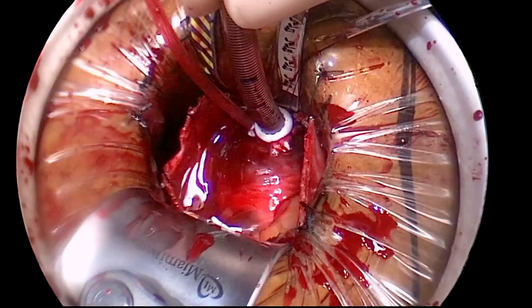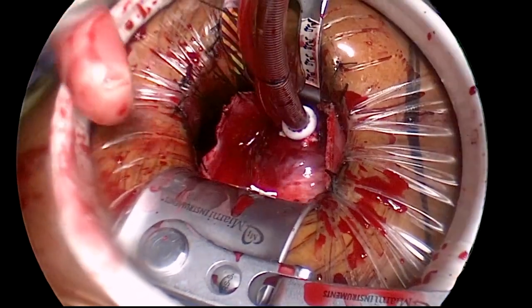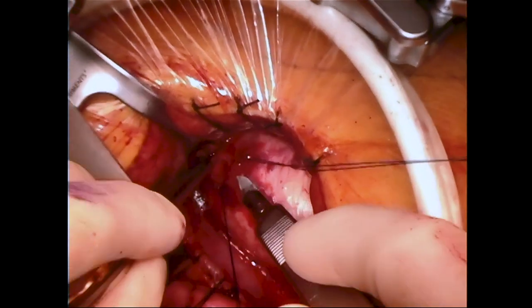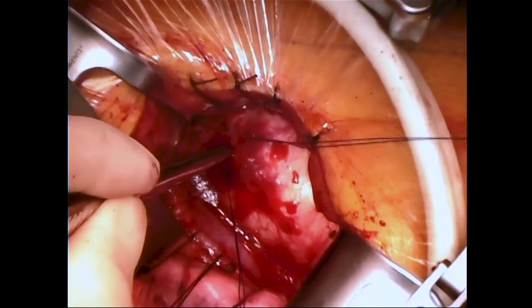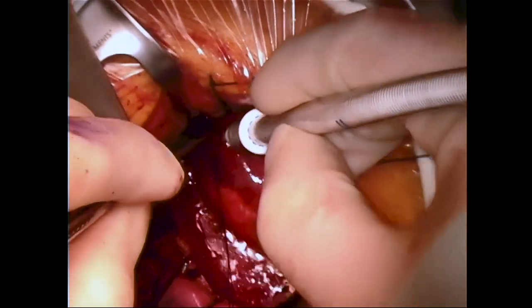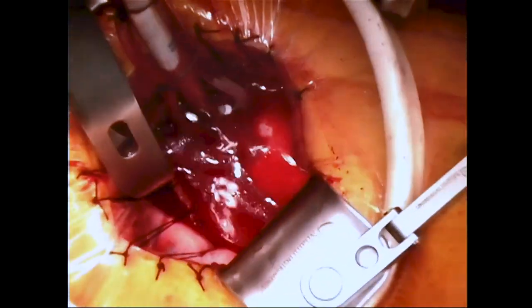Note that pediatric Rummel tourniquets are used throughout the case because of their lower profile. One may also perform conventional central aortic cannulation using a blade to make an incision followed by direct insertion of the cannula. We find the over-the-wire technique to be a little easier, particularly in obese patients.